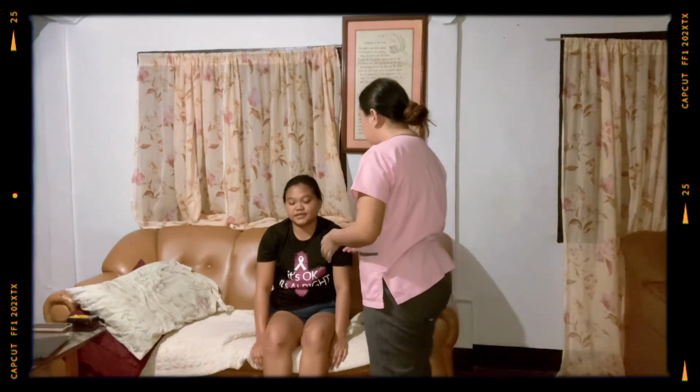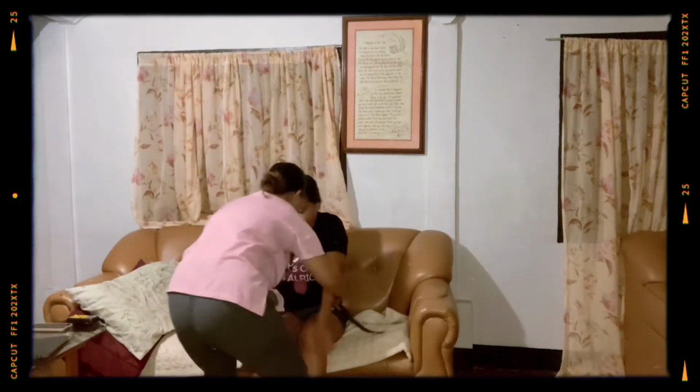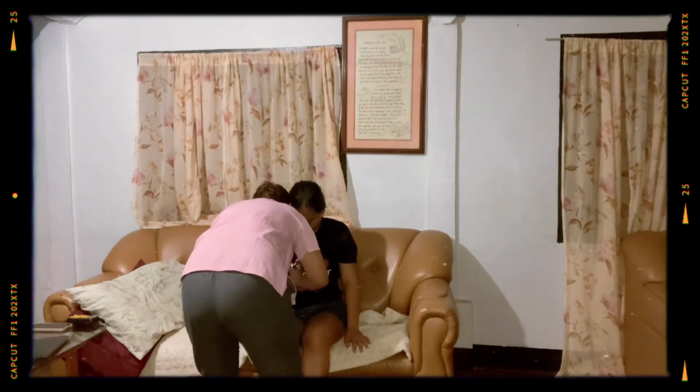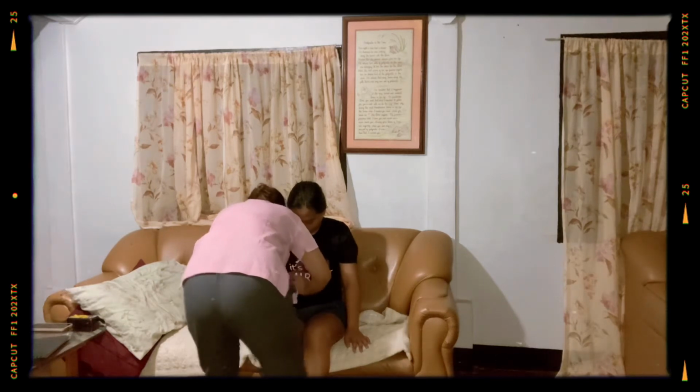So for procedure number 8, wrap the gait belt around the patient's waist based on assessed need and facility policy. So now I'm going to wrap the gait belt around the patient's waist, but first I'm going to ask permission. Okay lang ba mag-put ko weight? Yes, ma'am. Gait belt, ma'am. So we are going to put. So gait belt improve the caregiver's grasp, reducing the risk for musculoskeletal injuries.